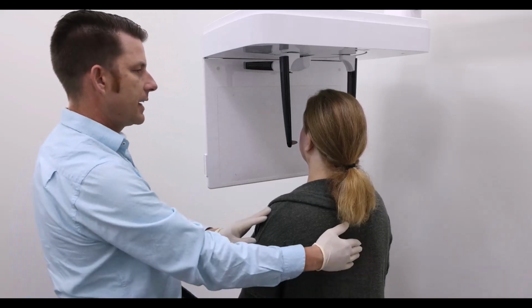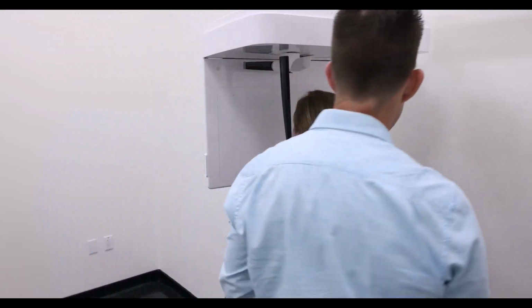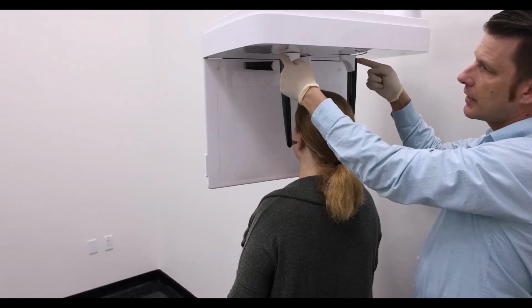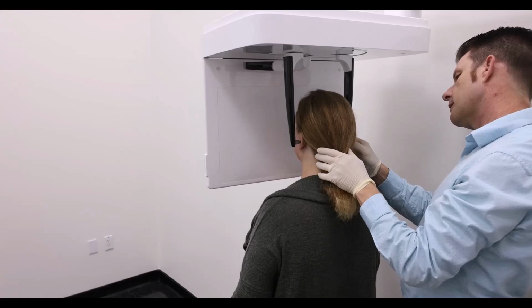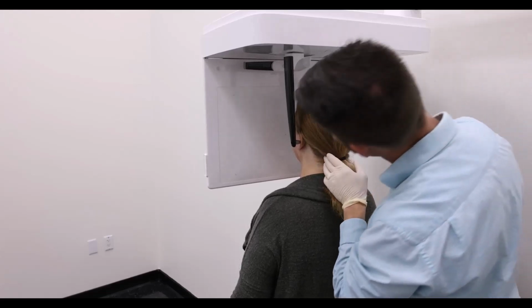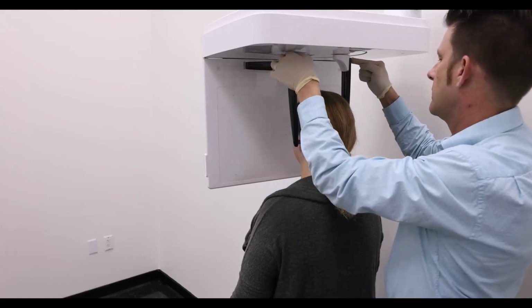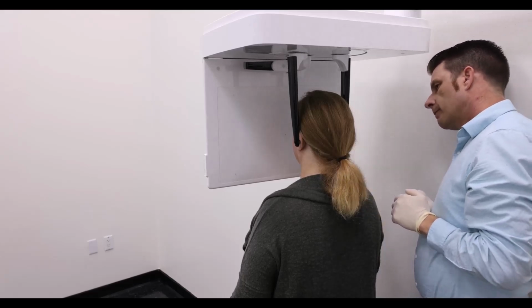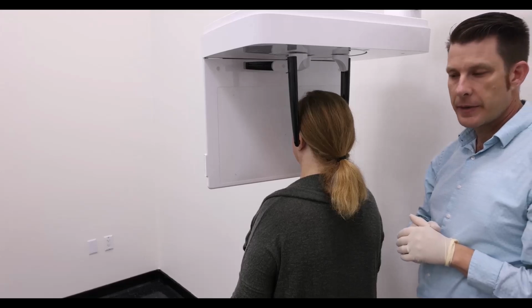I'm going to have you go ahead and take a small step forward. I'm going to switch over here so I can get her positioned. With my fingers at the top of the overhead, I'm just going to gently push these in and ensure that our patient is lined up. And I'm going to maybe rotate a little bit. We're going to move these in. I'm going to have the patient look forward. We're going to step out of the room and we're going to take our image.